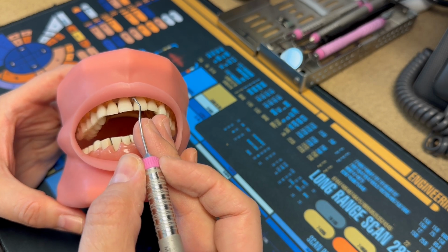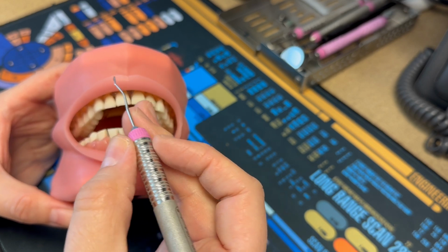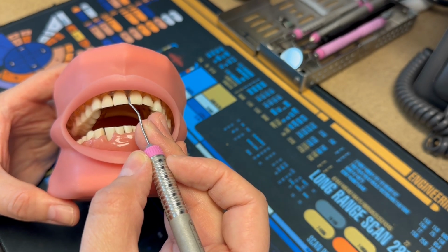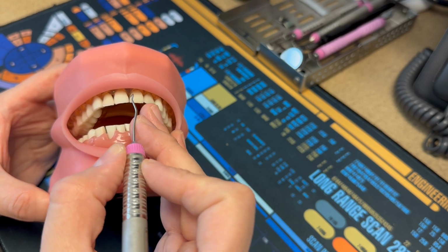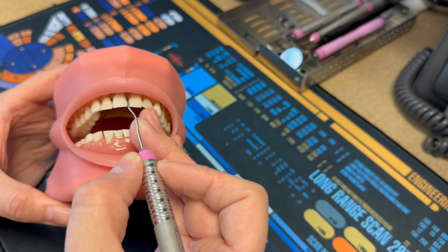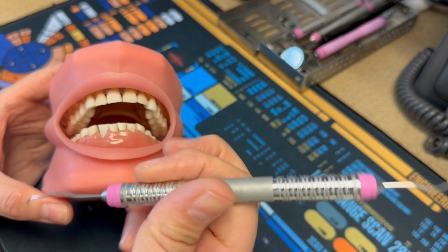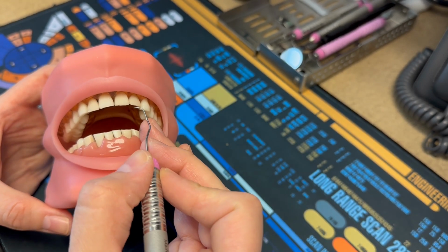If I were to check with the wrong working end, the lower shank would be parallel and right in line between 8 and 9, okay? And so that is anterior surfaces towards. So now I know which is my correct working end, and I'm ready to do my sequence.